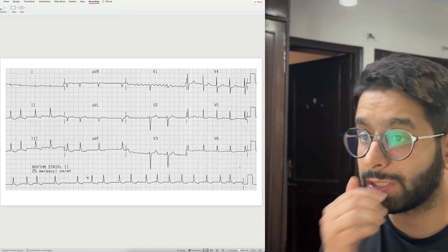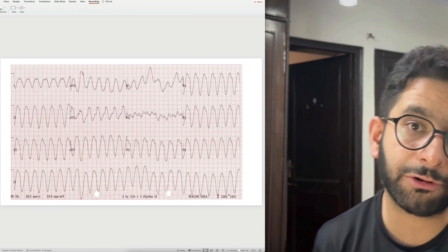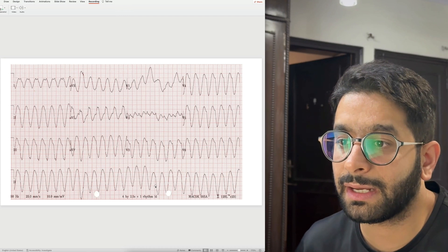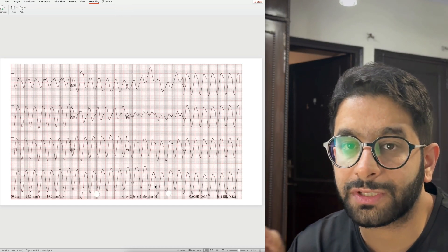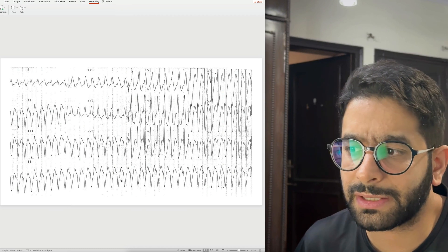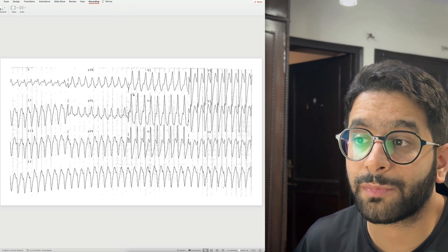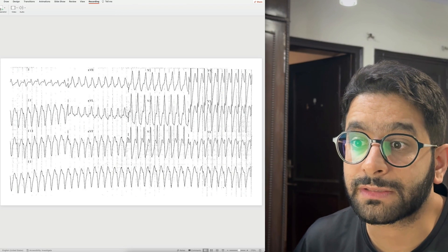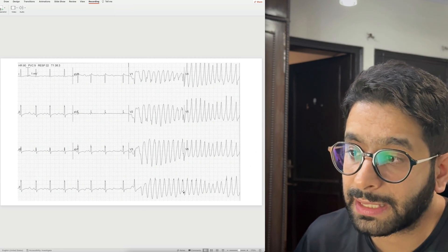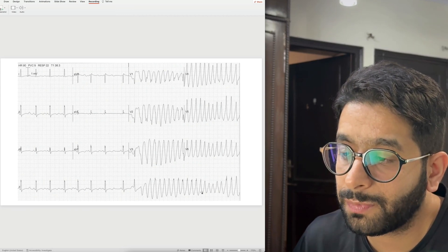Now this is tachycardia, but no longer narrow complex — this is a wide complex tachycardia. The QRS complexes are very broad, and the tachycardia is regular. One important diagnosis: this can kill a patient in minutes — this is ventricular tachycardia, monomorphic VT. A similar ECG here: wide complex, regular tachycardia — monomorphic VT until proven otherwise. An important tip: these ECGs usually have a positive aVR with northwest axis or extreme axis deviation.